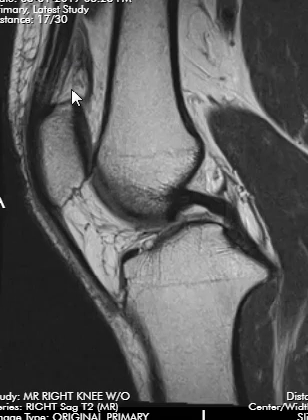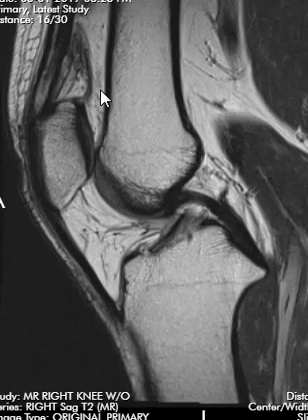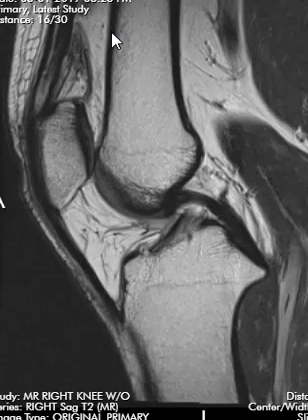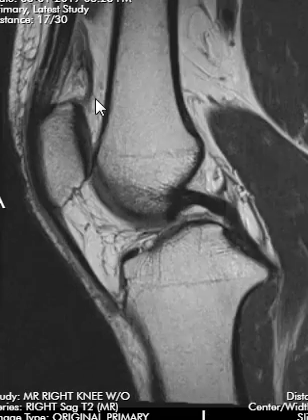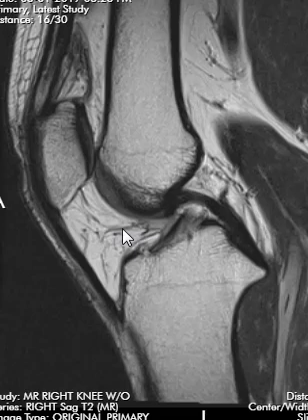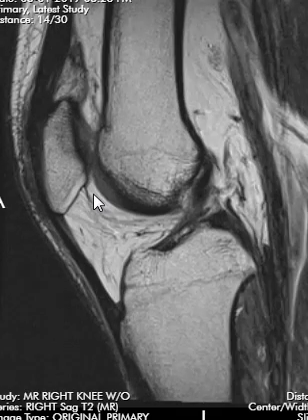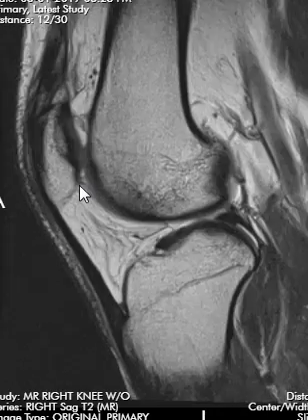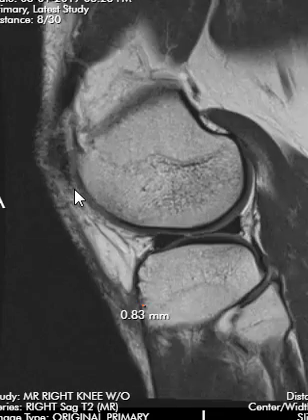Whether it's hypertrophied or swollen. The fat pad back here — I've never seen this inflamed before, though it probably has been and I've just never noticed it. This is the pre-femoral fat pad or the posterior suprapatellar fat pad back here. This is the quadriceps fat pad below, and this one is more commonly inflamed. A lot of times people will have patella alta, lateral patellar subluxation, and they'll get fatty impingement right over in the lateral superior corner right here, and that's actually quite common.